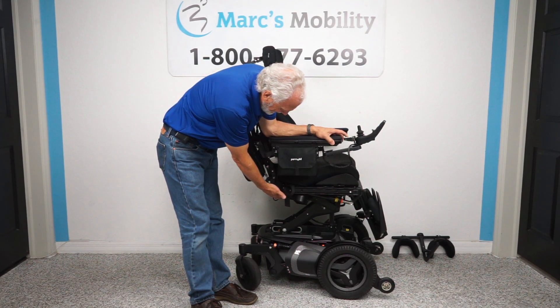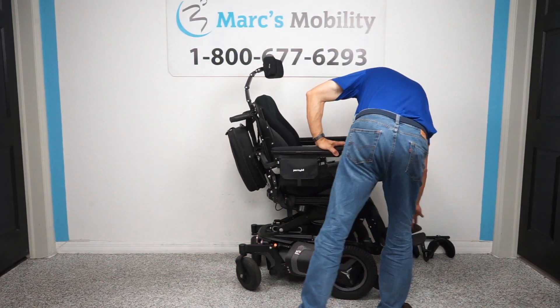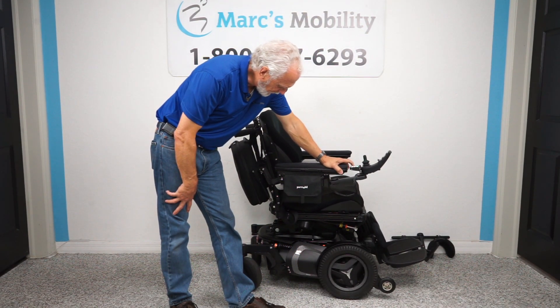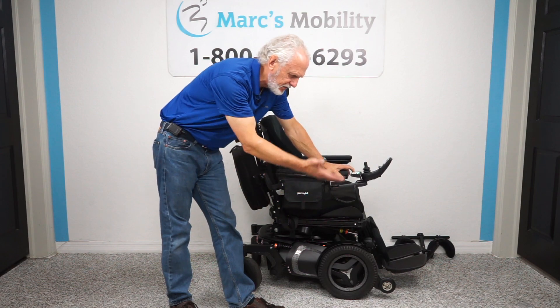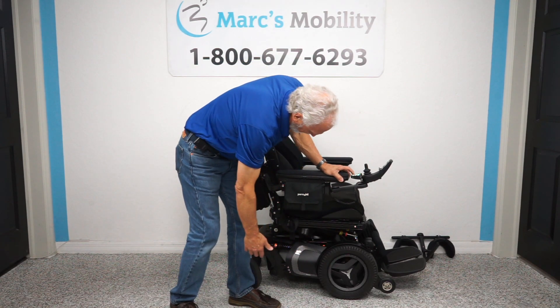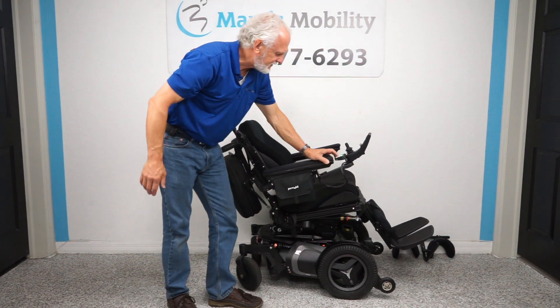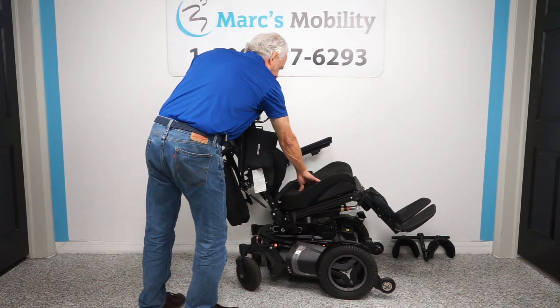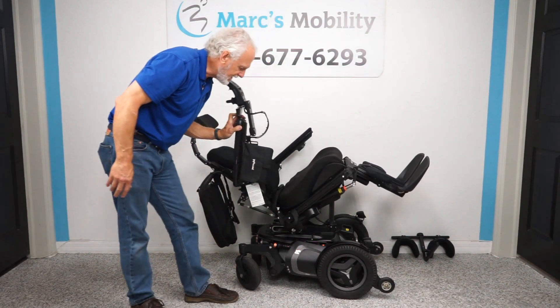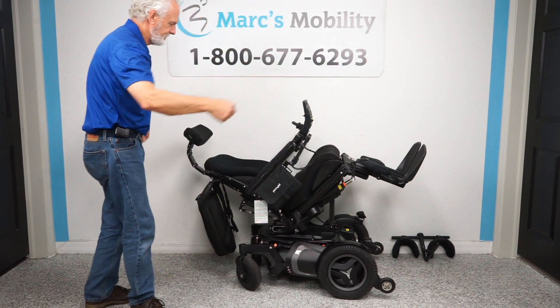Bringing the seat back down flat and then all the way down, we've now covered two functions. The next function is the tilt — when the seat bottom goes back, taking the legs and back with it. This has significant medical benefits: it takes pressure off your bottom and back, improves circulation in your legs, and lets you just relax. It's a very medically beneficial position.